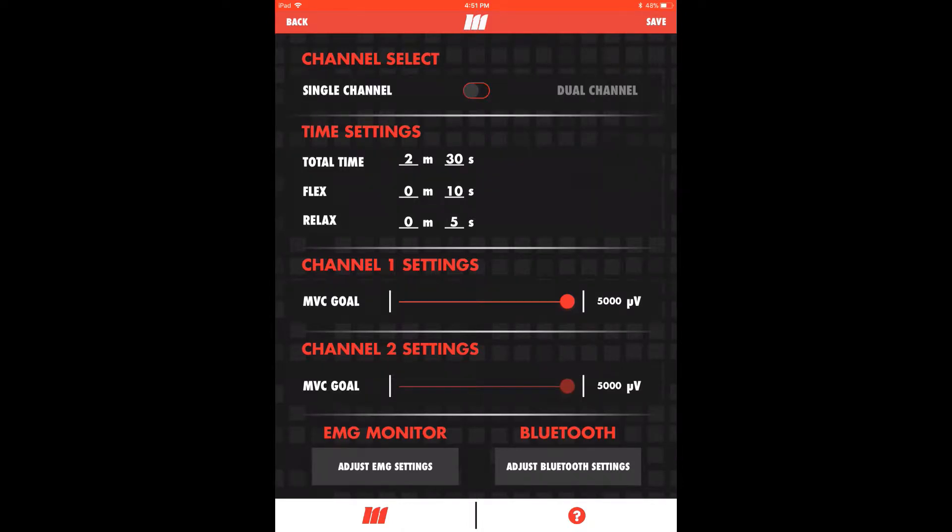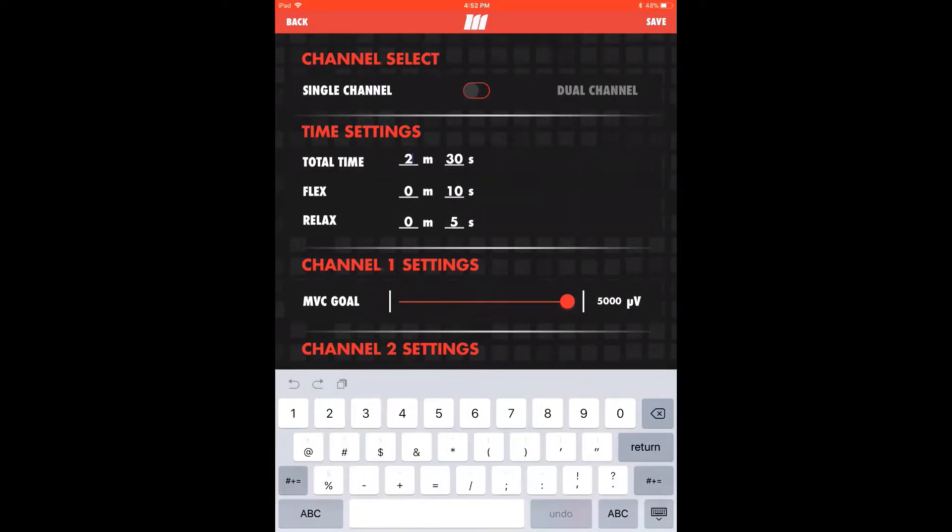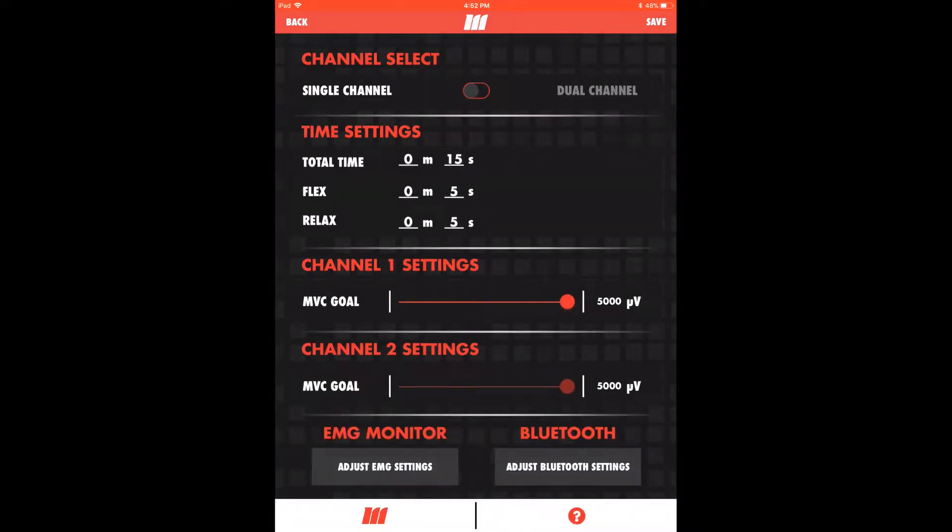First, toggle to single channel. Next, move to time settings to adjust total time of exercise and flex and relax time for each rep. For demonstration purposes, we'll set 15 total seconds with equal flex and relax periods of 5 seconds each. This is where you'll begin to customize the session using your own protocol. For a sample protocol, see the downloadable resources on our Getting Started page.